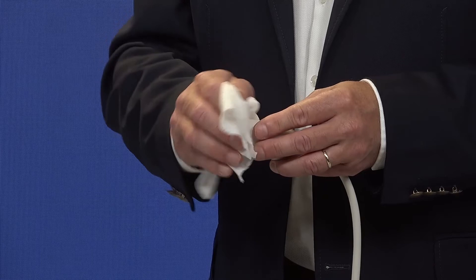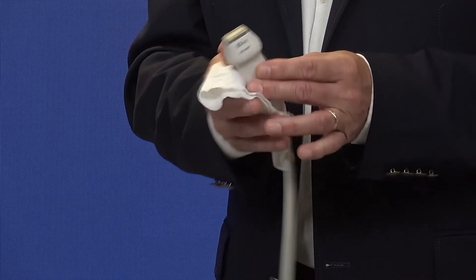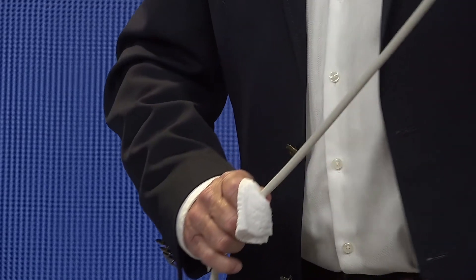When using a wipe, take the wipe out of its container and carefully wipe the transducer and cable, again using the same technique as before when disinfecting the contact surface of the transducer.